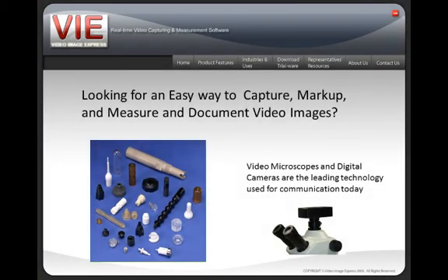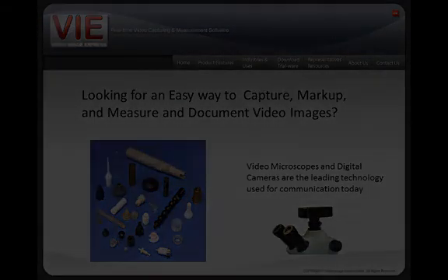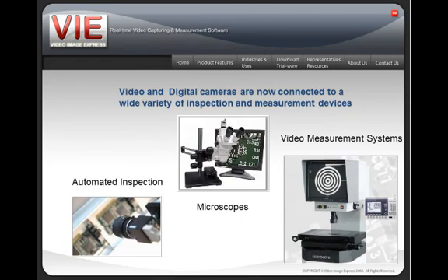Are you looking for an easy way to capture, markup, measure, and document video images? Video microscopes and digital technology have become the leading technology for communications in businesses today. Video and digital cameras are now connected to a wide variety of inspection measurement devices. We interface to automated inspection systems, microscopes, and video optical comparators.